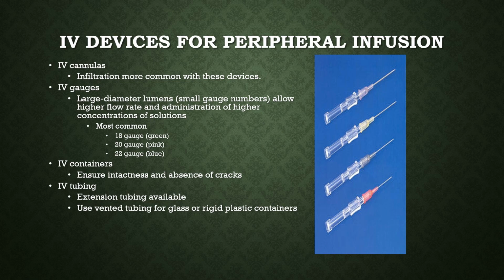So I will just tell you, as a little bit of an interesting tidbit, when I first graduated from nursing school, we believed that if you didn't run continuous fluids, the IV would clot off if you didn't put some heparin in the line. So what we would do with our patients with medlocks, which is just an IV access without fluids running through it, just a little plug on the end, after we finished, let's say, giving IV antibiotics, we would literally do a saline flush, and then we would do a heparin flush. It was just 10 units of heparin, so it wasn't much. But we did flush with heparin after we flushed with saline, and that made us feel like it wasn't going to clot off.